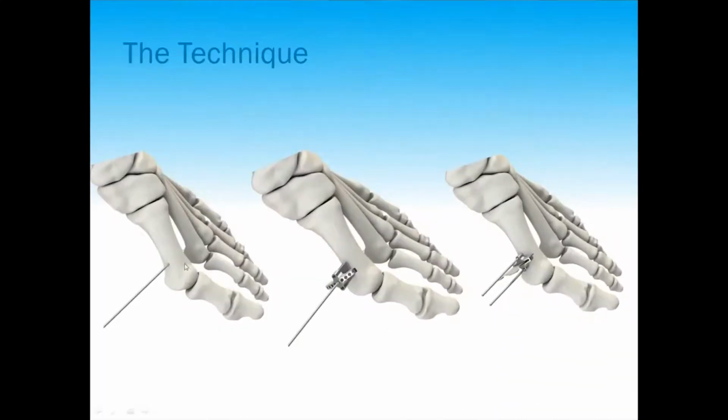So with this wire, you insert it, and then there's a special guide. Again, the real advantage of this technique is not only is it kind of step-by-step and guides you through it, but it gives you the intraoperative tools or instruments to provide accurate correction. And that's something I think is lacking in a lot of other systems and not really out there.